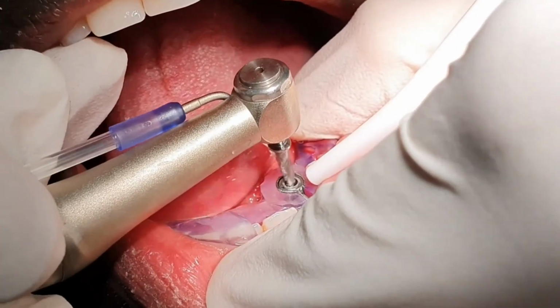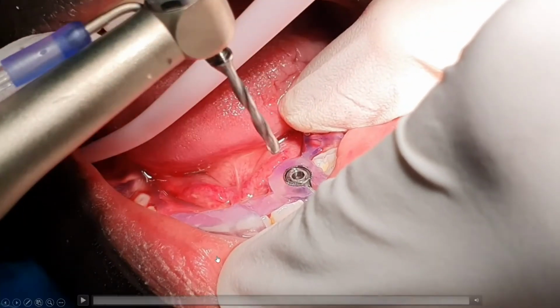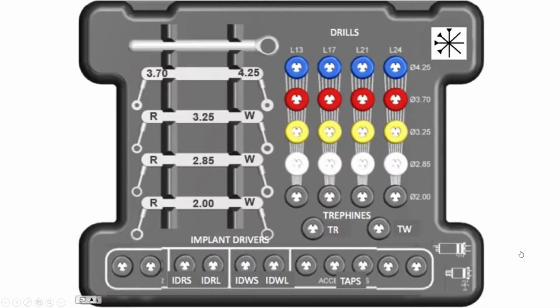Now he's not drilling down to 24, he's only going 15 millimeters into bone, which is the first part. The rest of this burr is being taken up by the length of the template and the spoon. So if you like, some 9 millimeters or so is in this area here and going through the gum. There's a stop here, so there's no need for any measurements because you're just going to go all the way down until you rest on top of the spoon. And then of course we will be ready for the next stage.